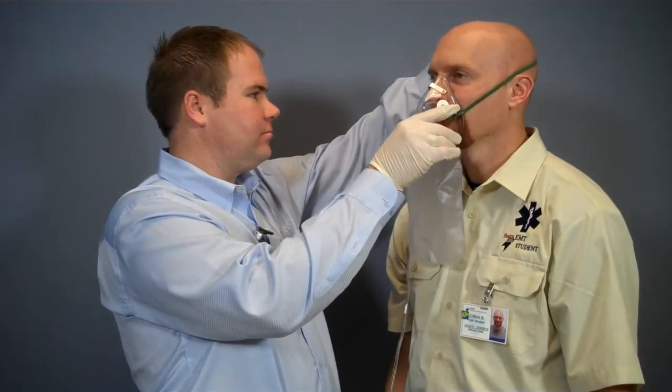If the patient does not tolerate the non-rebreather mask, I may be able to switch to a nasal cannula.